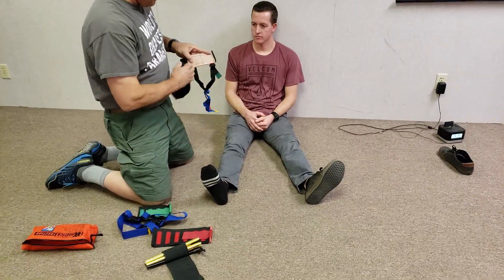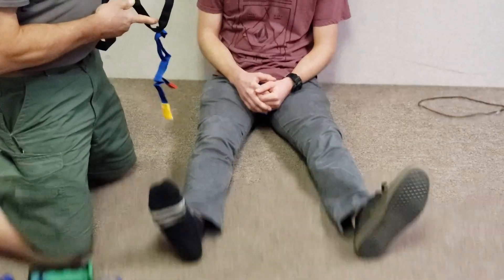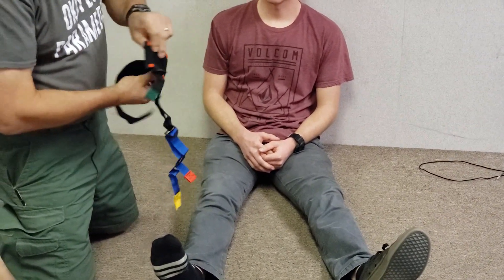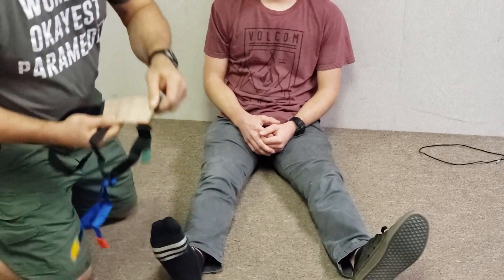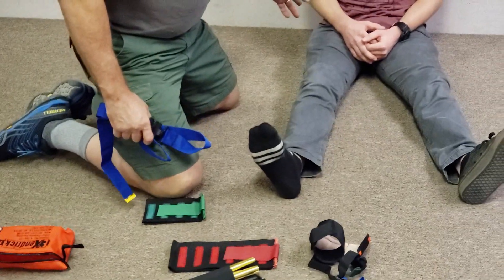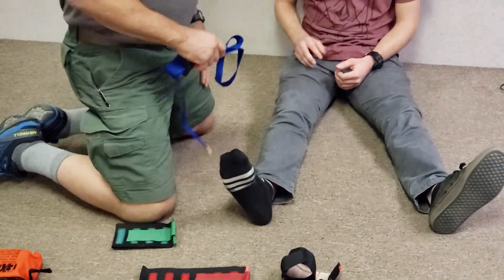The hardest part about using this device is the ankle. When you first pull out the ankle piece it's usually wadded up in a knot, so you orient yourself to it by identifying that triangle and the pad, and that gets you set up.